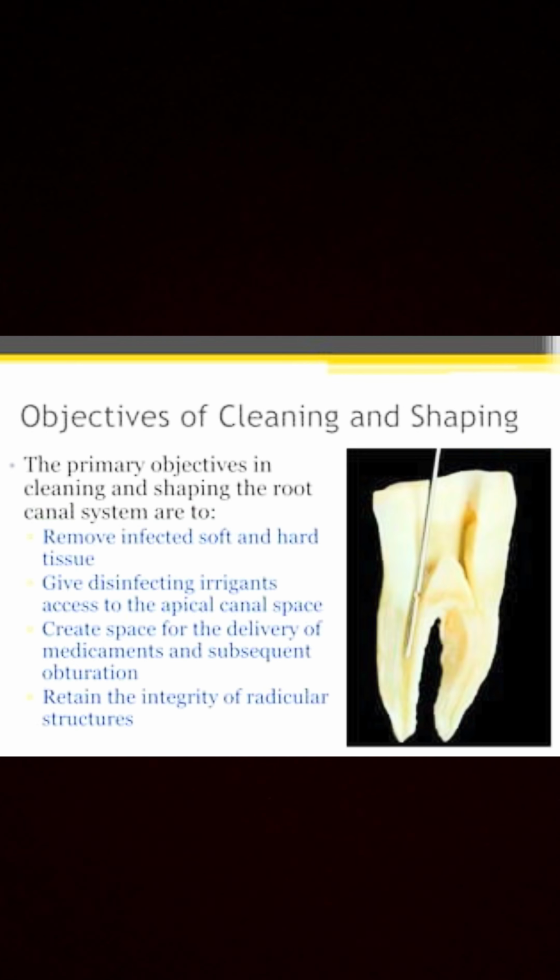Tip design. Original stainless steel root canal instruments usually possess a sharp cutting tip. Rotary instruments currently are manufactured with modified non-cutting tips, as these non-cutting tips cause less canal transportation and remove debris better than traditional instruments.